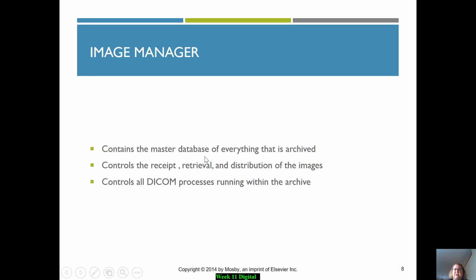We want to make sure that we have masters in all of our databases, so a master copy is stored. Even when you are doing an image in lab, there's that original image that you've taken that automatically gets stored, and then whatever changes. As soon as you submit, that's why when I had you watch that PACS video, it's hard to undo, because that master copy's been saved. So you have to go to your PACS person and explain to them what happened. There's a control process in place with those, and that's going to be that PACS administrator when you run into any difficulties.